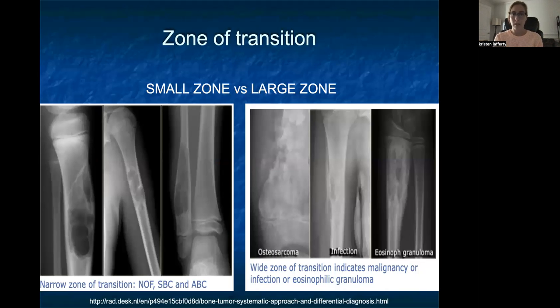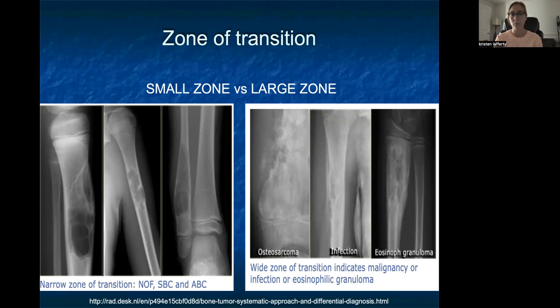Another thing that helps us decide radiographically between benign and malignant lesions is something called zone of transition — where does the lesion start and end, and can we differentiate normal bone from the lesion? A small or narrow zone of transition is usually considered a benign characteristic. Looking at the radiograph on the left, you can see a bone lesion and pick out where normal bone ends and the lesion begins, versus the radiograph on the right showing a more malignant lesion where it's really hard to tell exactly where the lesion is.